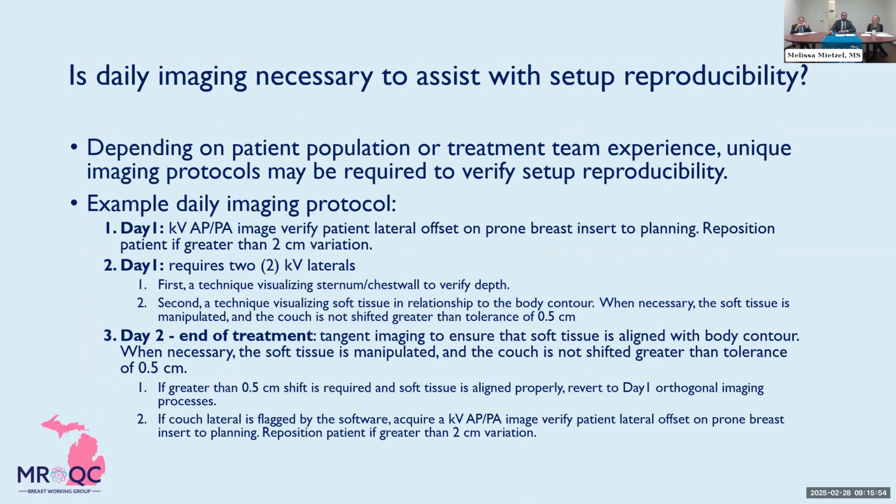So is daily imaging necessary to assist with setup reproducibility? Depending on the patient population or the experience of the treatment team, unique imaging protocols may be required to verify patient setup reproducibility. Again, this can vary from imaging weekly or imaging every day. An example of a daily imaging protocol is shown below.